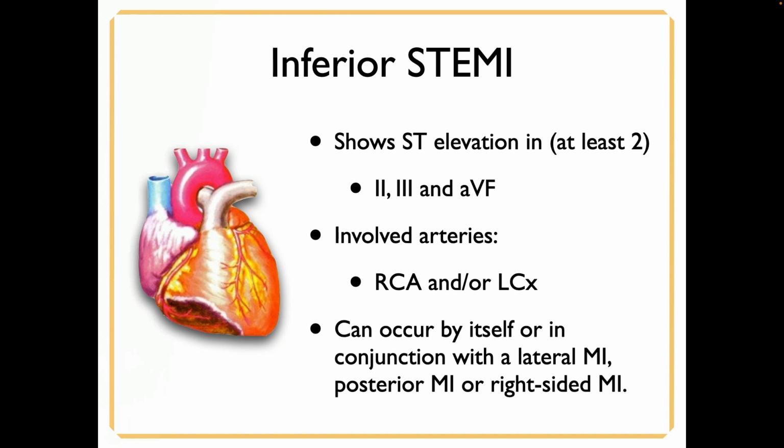Inferior STEMIs, it's kind of rare to see just an inferior STEMI. You do sometimes, but typically they are in conjunction with either a lateral, a posterior, or right-sided, meaning that they happen together.